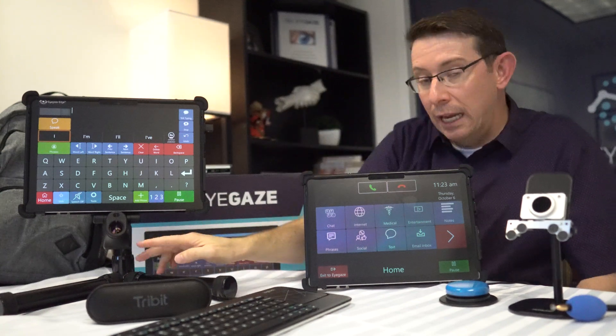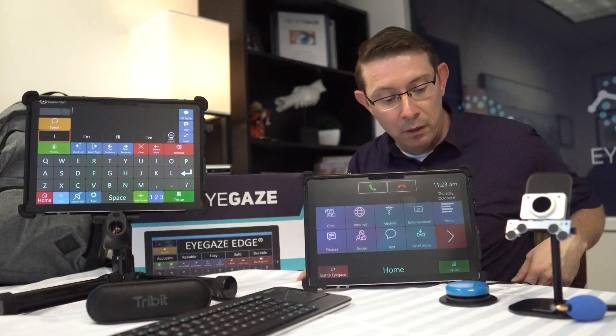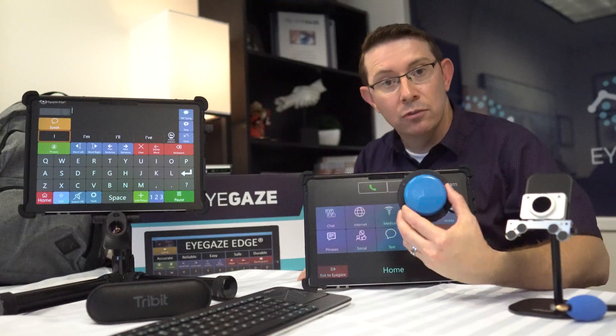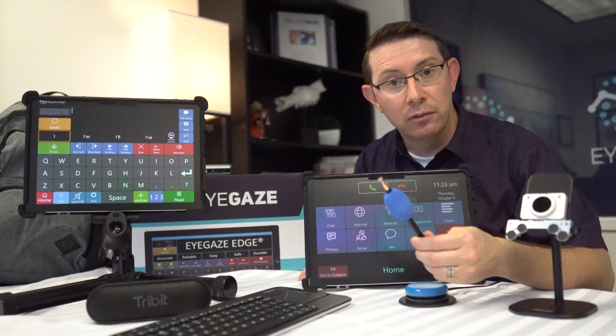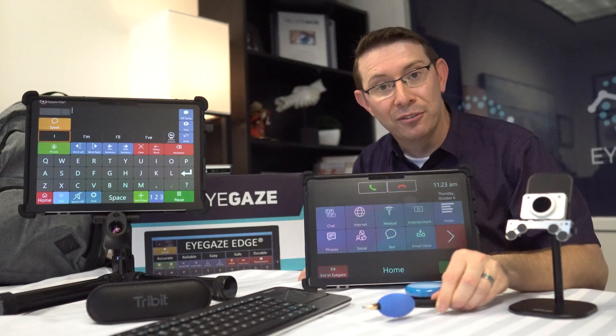For people who can't use an eye tracker for some reason, you can also use the iGaze Edge with a switch, with a head mouse, or with a stylus like you see here for direct selection on the screen.